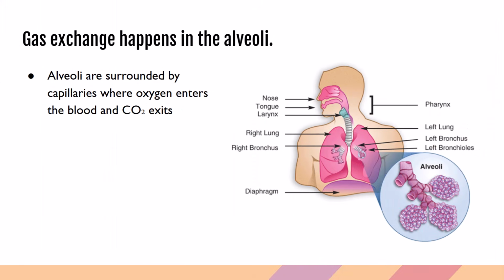As far as physiology, gas exchange happens in the alveoli. The alveoli are the functional units of the lung. They're little balloon sacs where gas exchange takes place. Oxygen diffuses into the bloodstream and carbon dioxide leaves. They might be tiny, but there are millions of them, and they're filled with air, which makes them poor conductors of ultrasound, and that's why normal lungs are mostly artifact.